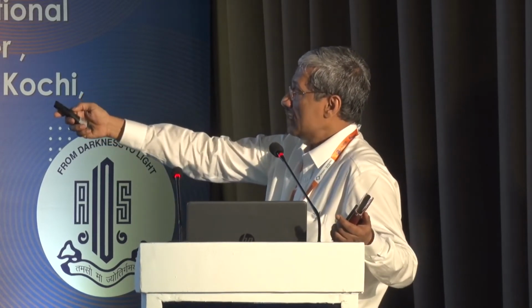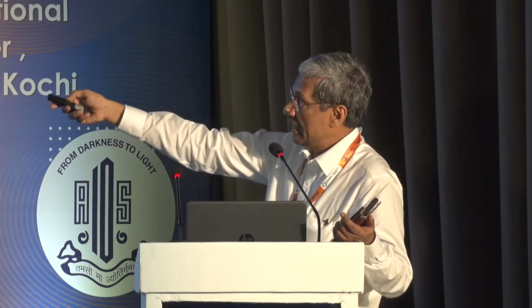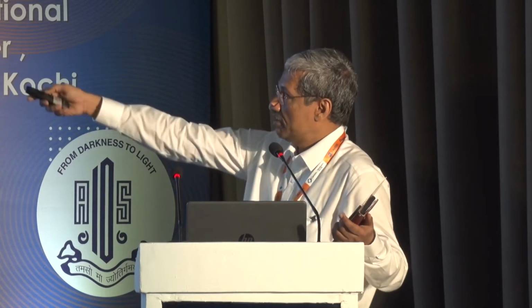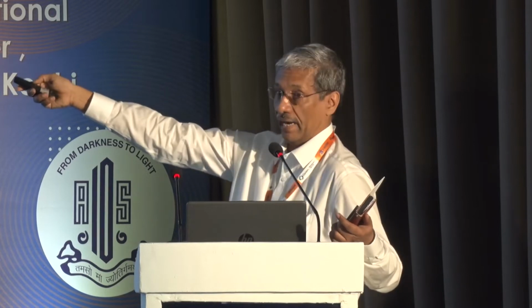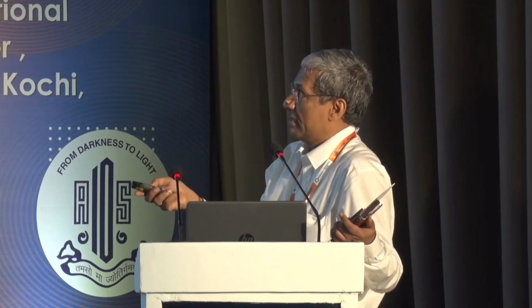But if you look at the central topo of the Zeiss IOL Master 700, you will find that it's a very irregular one, and you can see an area of red which shows that there is steepening. So this is not normal. If you look at this particular patient and you want to see whether to put a toric lens, you'll say, yes, I will put a toric lens. But if you see the right-hand side, there is more steepening than in the left. So there's a little bit of irregular astigmatism there.